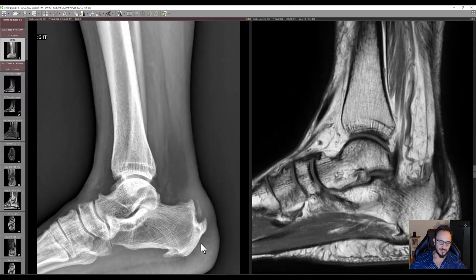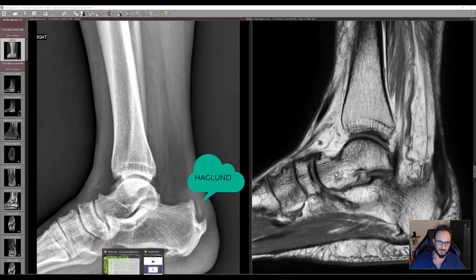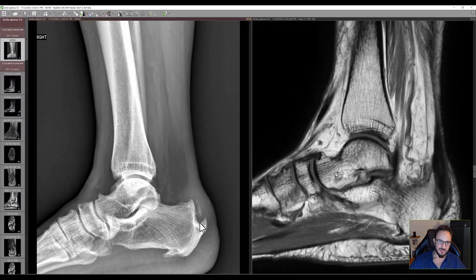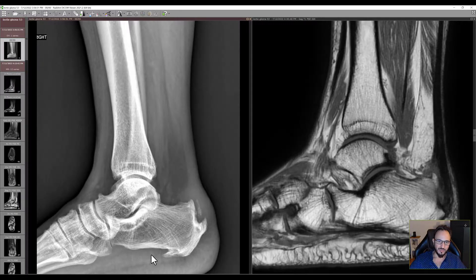And this is a typical aspect of a Haglund deformity. What is this Haglund deformity? This leads to the Achilles tendon to be impinged by this bony spur here. So this is a very very clear Haglund deformity.